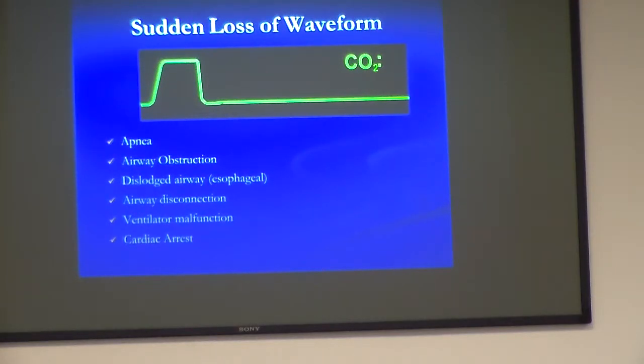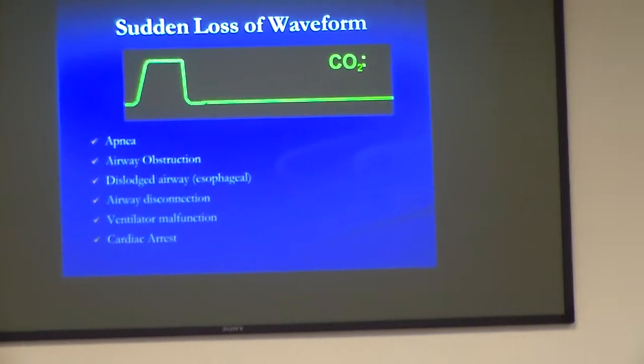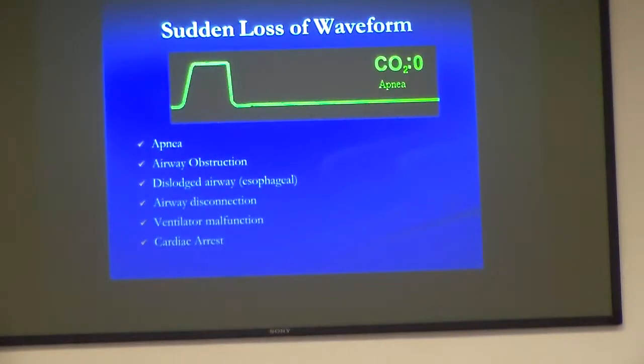Got the patient on our ventilator, the end-tidal CO2 had been 37, 38, and I had a 99% pulse oximetry, so I was happy. We moved the patient, and of course the monitor is at the front of the gurney, so I asked the medic, okay, what's my end-tidal? And he goes, 0. And I thought, it can't be 0. Like, we just had a 38 end-tidal.